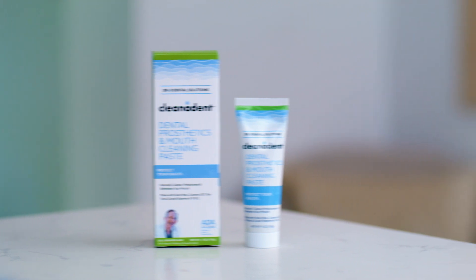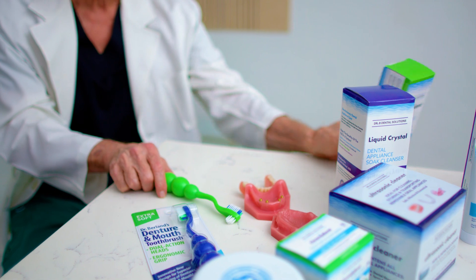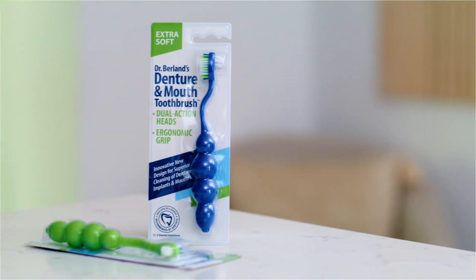Then we have the Clean-It paste. It's essential that you brush your teeth and brush your gums with the Clean-It paste at least twice a day, using the Dr. B denture and mouth toothbrush.